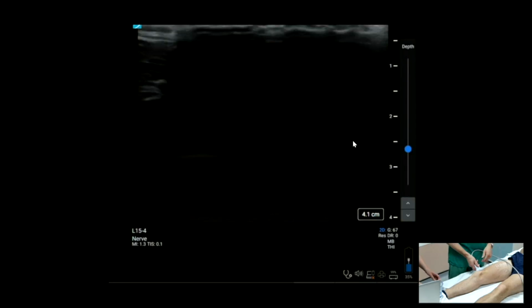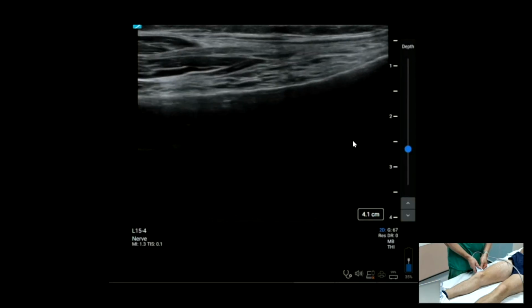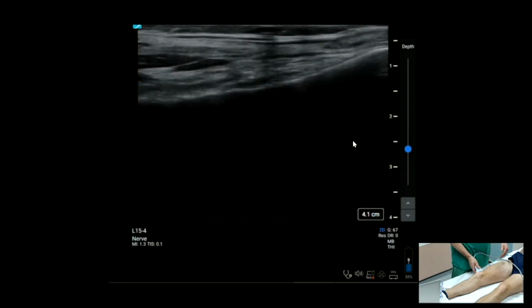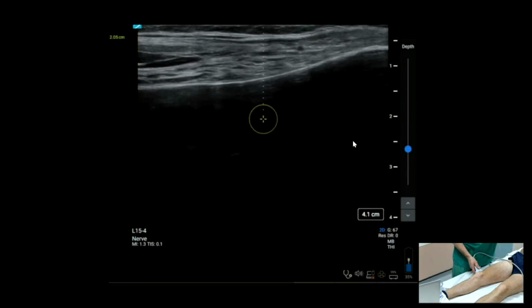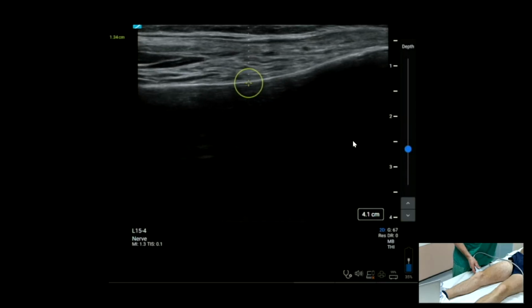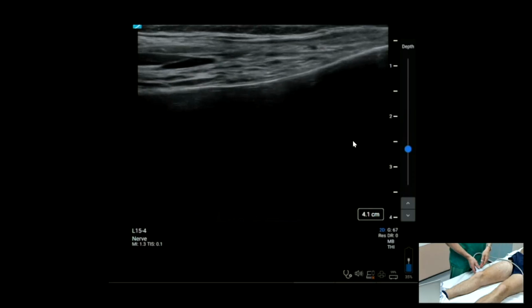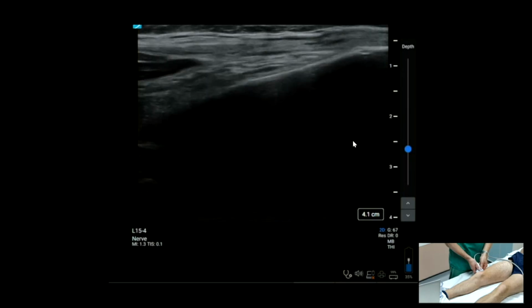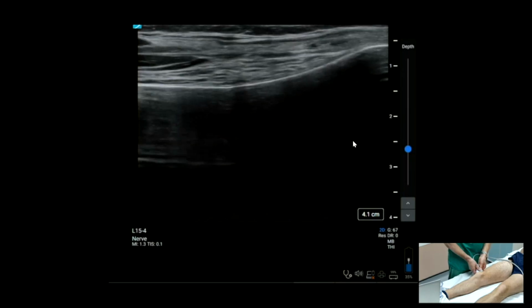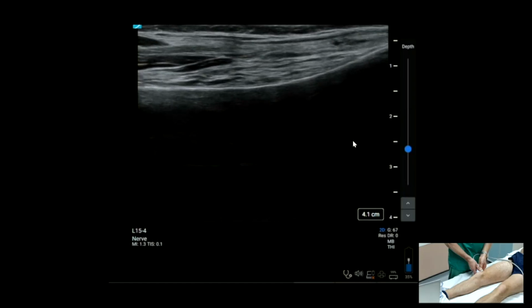So I'm now going to the superior lateral. I'm putting my probe on the other side of the leg, and we've got a similar kind of picture: the femur is relatively flat, and then there's a point at which it flares up, roughly about here. Now on this side, you can't see the geniculate artery, but it doesn't matter. You just put your needle there and inject, and you should get it anyway.